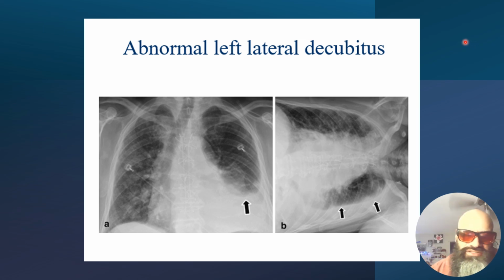So we place him in the left lateral decubitus position here in this situation, since the density was found on the left region of the chest. You can notice that gravity, when you're upright, will tend to pull liquids in all structures such as swelling, blood, anything distally towards the lower extremity.